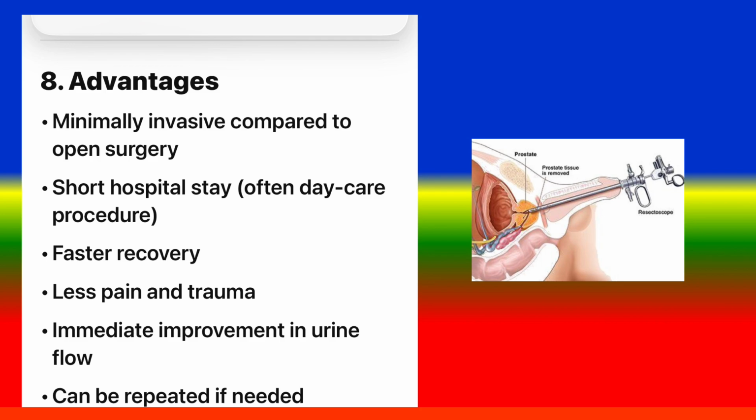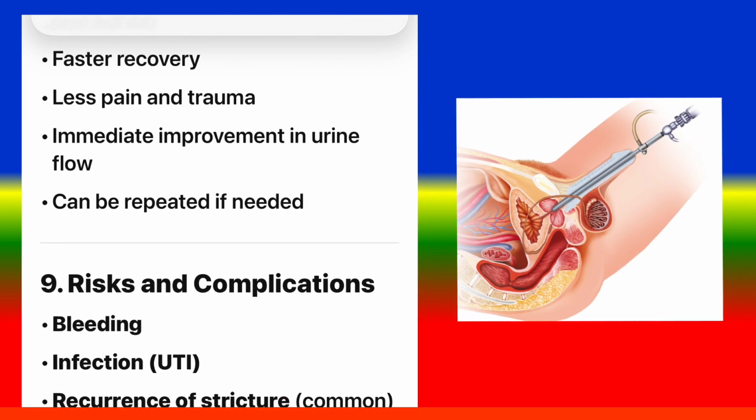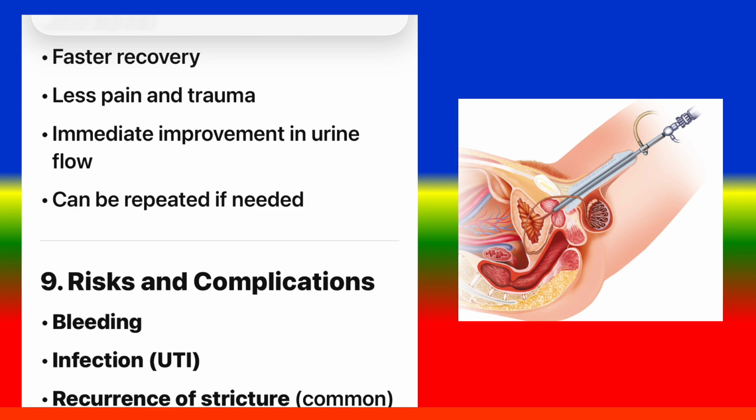8. Advantages. Minimally invasive compared to surgery, short hospital stay, often a daycare procedure, faster recovery, less pain and trauma, immediate improvement in urine flow, can be repeated if needed.